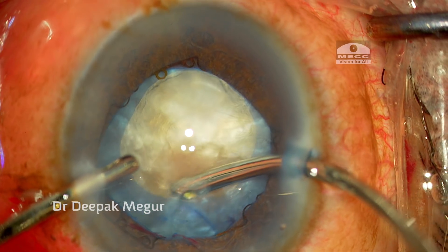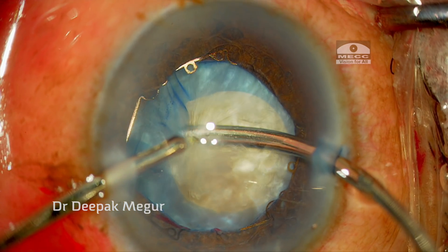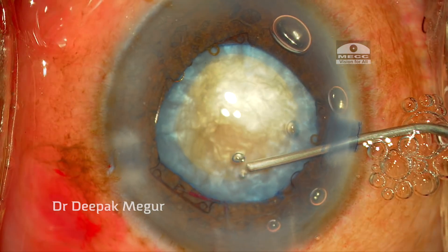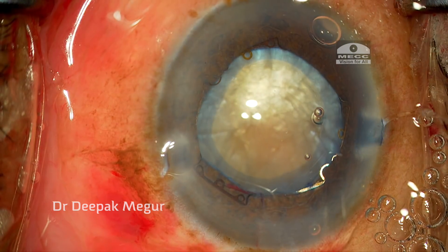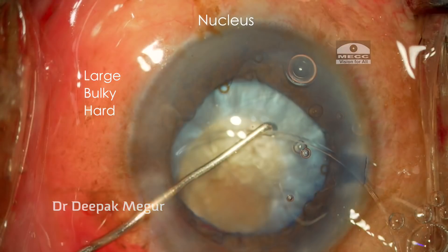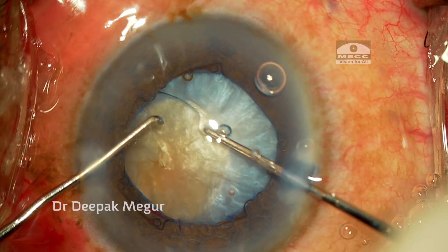Before using the CTR, I prefer to debulk the cortex a little bit so that the cortex does not get entangled in the CTR and helps cortex aspiration later in the surgery. While removing the cortex, I can again see that the bag is quite freely mobile and the zonular health is really not great. After removing the cortex, I create some space by injecting OVD under the anterior capsule and then thread the CTR. I realize the nucleus is quite hard, large, and bulky, and the bag is moving as the ring is being manipulated into it.